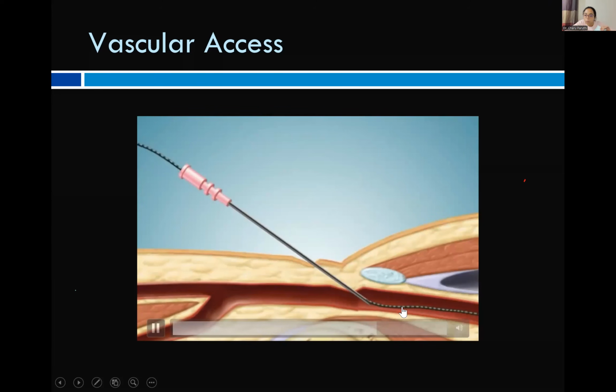So through this, we insert the guide wire, which is now inside the vessel lumen, and the needle is removed. So now only the introducing guide wire is inside the vessel. Now this guide wire is slightly straightened, and over it, the vascular sheath and dilator assembly is inserted inside. The dilator and the guide wire are both removed, and the sheath remains in situ. This has a hemostatic valve, which we'll just discuss. And through this, multiple catheters can now be passed.